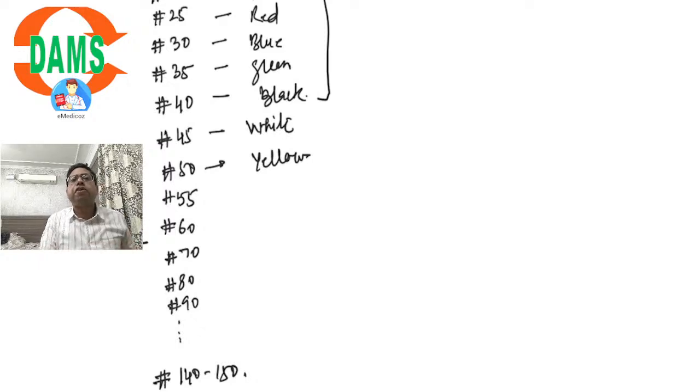So these are some of the important aspects you have to remember. First thing, what does the size indicate? It indicates the diameter at the tip, which we call D0. There is a certain color coding that is to be followed: white, yellow, red, blue, green, and black. These are the 6 standard colors that will keep on repeating cyclically. Another important thing is that from size 15 to size 60, there's an increment in size of 5.